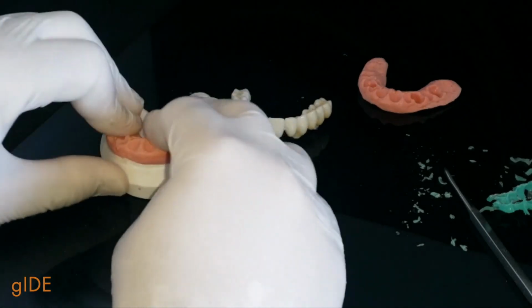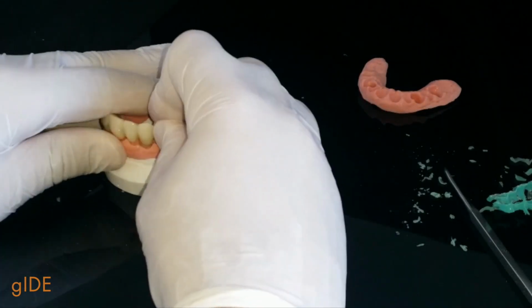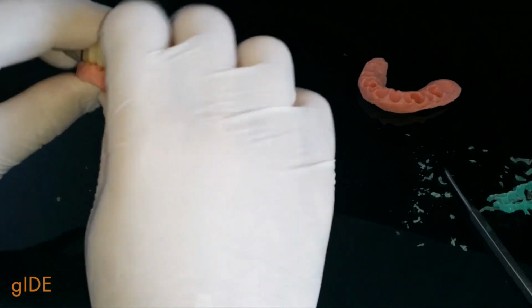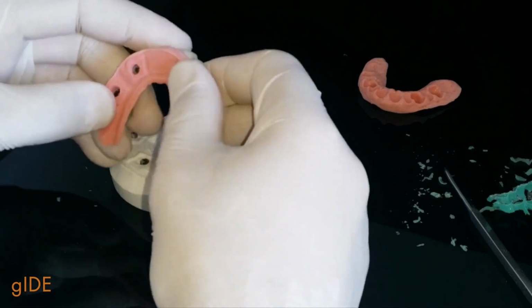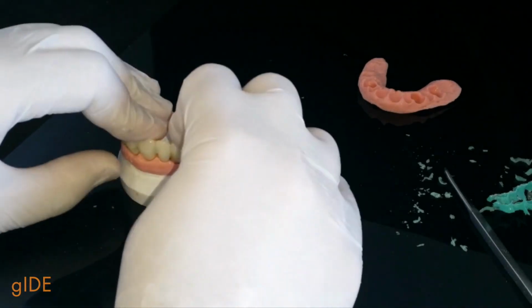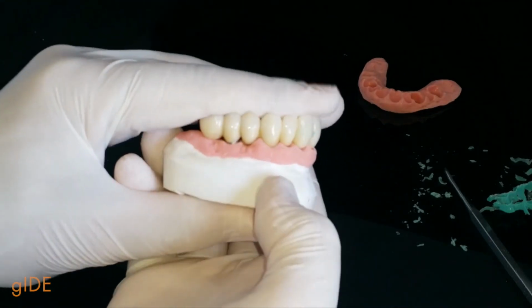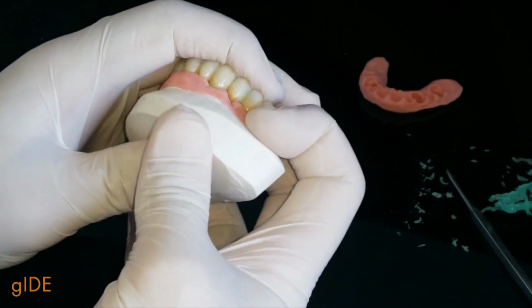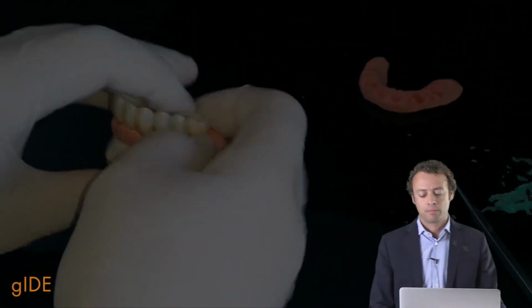But if I put on the model the first soft tissues that I got from the plaster, and now I try to put the temporary restoration on the same model, you can see how I don't have any chance to have a good seating, because the soft tissues are completely different. So how can we think that our dental technician can create a good framework, a good rehabilitation on this kind of models? And this is really a key point that makes the difference.